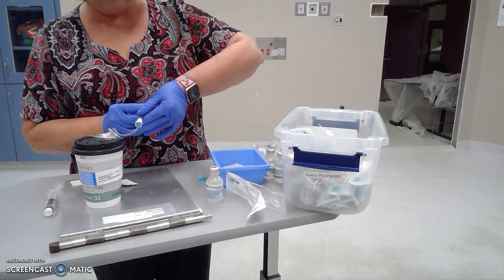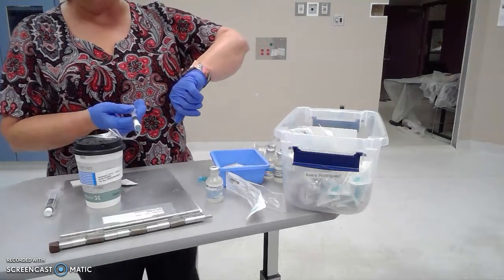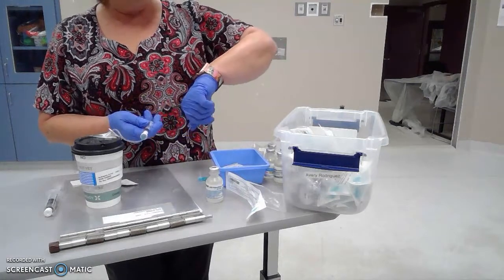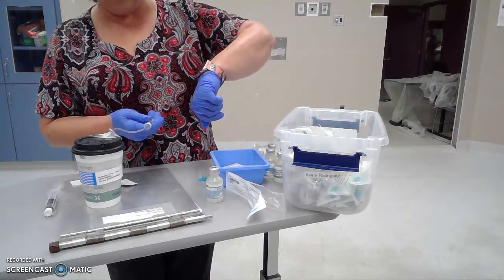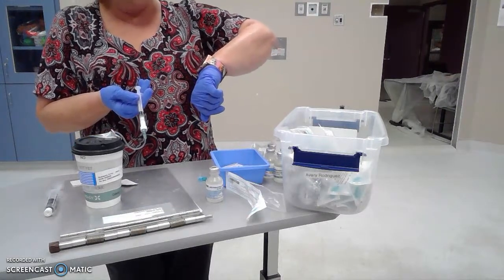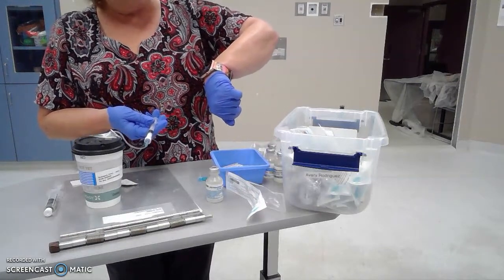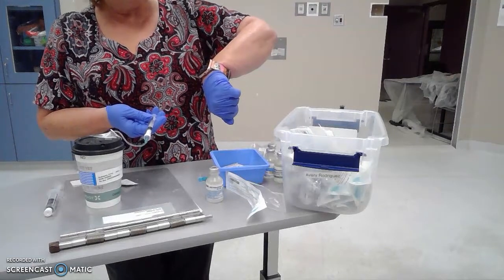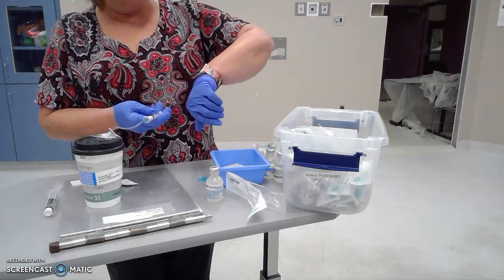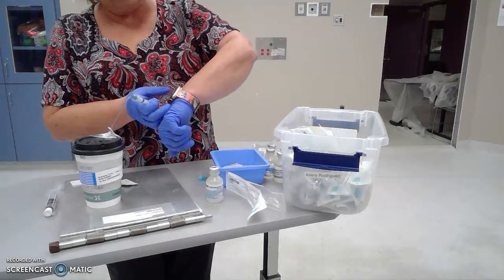And it's hard to push that little bit, so you have to be careful so that you don't accidentally push all of it in one push. So be very gentle, and you do have to practice. And if you have an Apple Watch, your hand keeps disappearing. Okay, I did my second 0.25, so that puts me at the 0.5 mark. I'm still watching my second hand. Okay, now I'm pushing the last 0.25, and I still have 15 seconds that I need to wait.